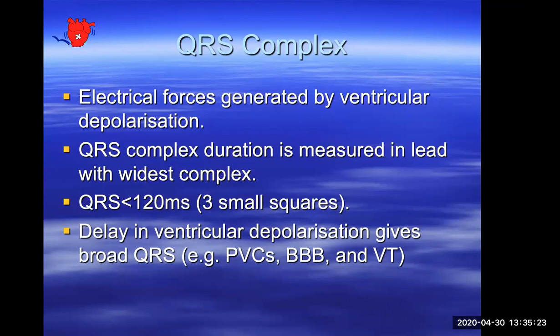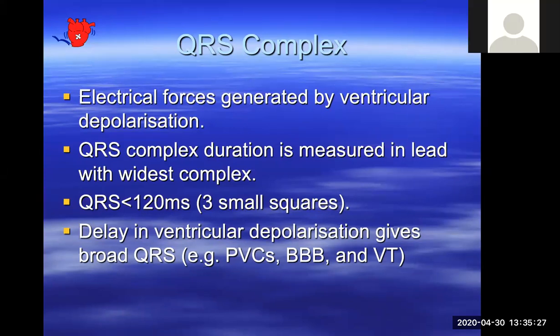And the same if somebody has ventricular tachycardia, by default the QRS would be wide, because it is produced by the myocardium, it transmits through the myocardium to stimulate the rest of the myocardium, and it is slower. Even though the heart is faster, the electricity itself takes longer to conduct to the whole myocardium, giving you a wider QRS.